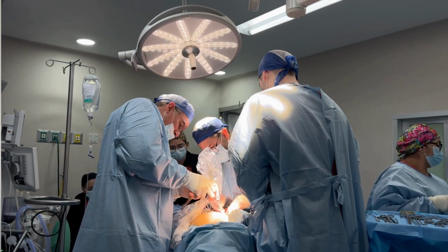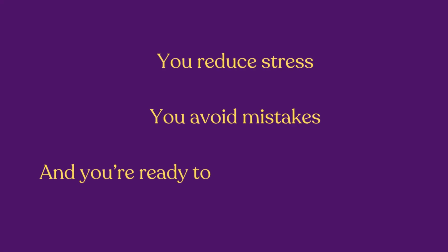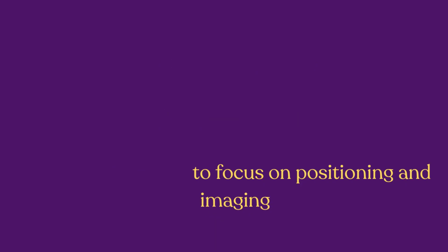For many students, this step can feel intimidating, especially in a high-pressure OR environment. But here's the key. Confidence comes from preparation and repetition and understanding your workflow, not just your technical skill. If your workstation is set up properly before the surgeon arrives, you reduce stress, you avoid mistakes, and you're ready to focus on positioning and imaging.